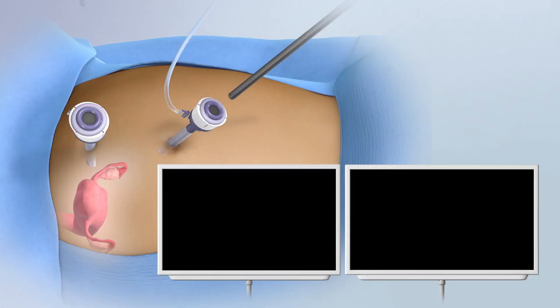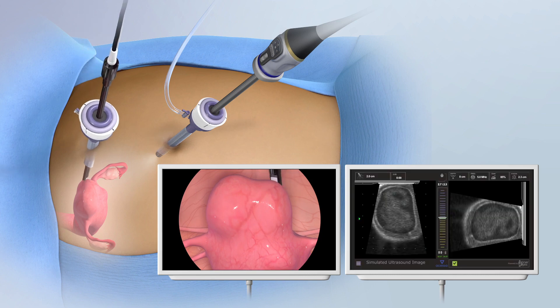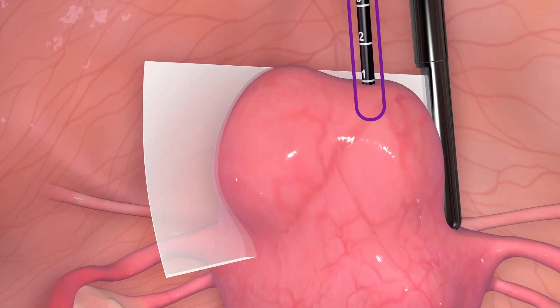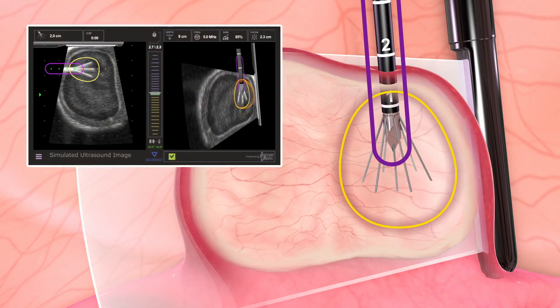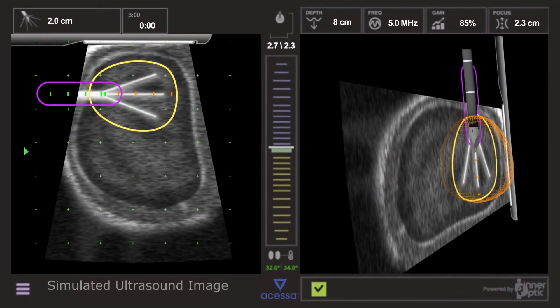The procedure is performed using a standard 5 mm laparoscope and a 10 mm laparoscopic ultrasound probe for visualization of nearly all fibroids. Under ultrasound guidance, the Acessa handpiece is inserted into the fibroid and the seven thin needle-like electrode arrays are deployed into the fibroid tissue. The guidance system overlays the ultrasound image with the projected path of the handpiece.